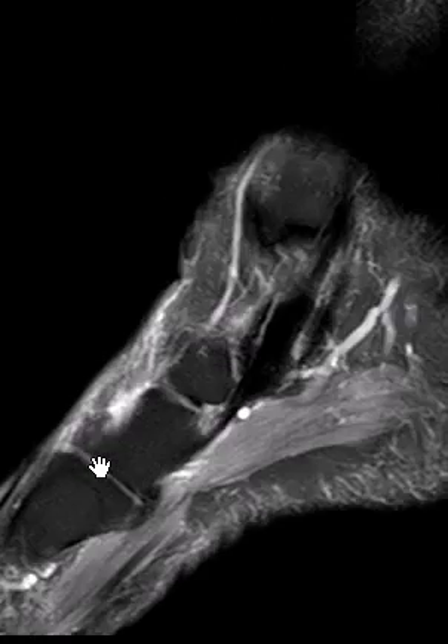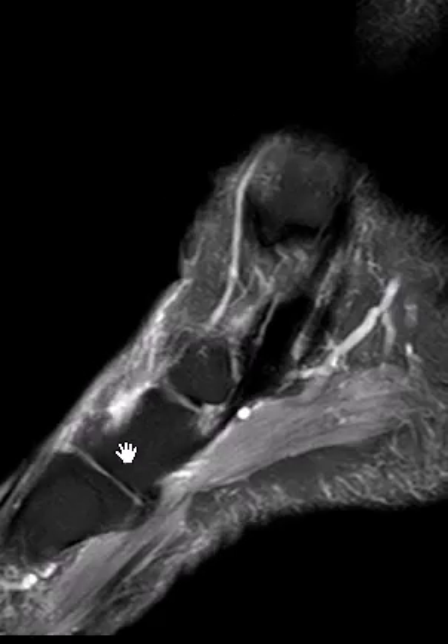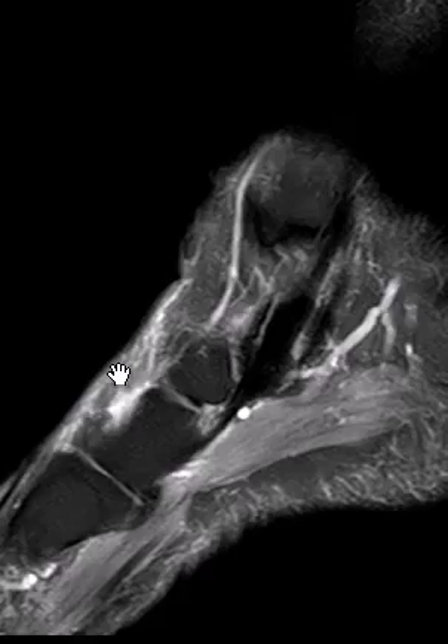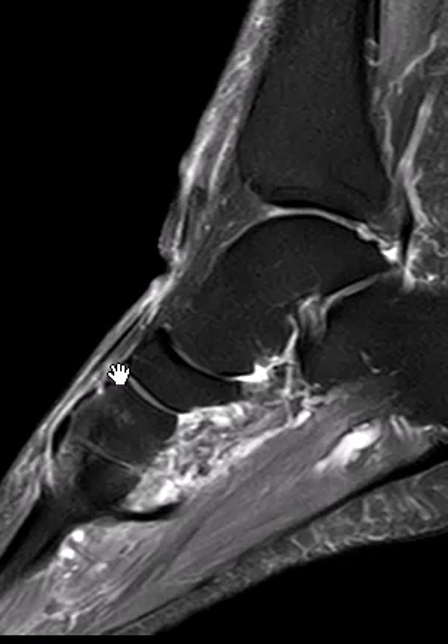This attaches distally on the first metatarsal base, and also the medial cuneiform bone — it attaches to both of those typically. The torn end was about right here, as we can see on another view. So this is a ruptured anterior tibial tendon with mild tendon retraction. Thank you very much.